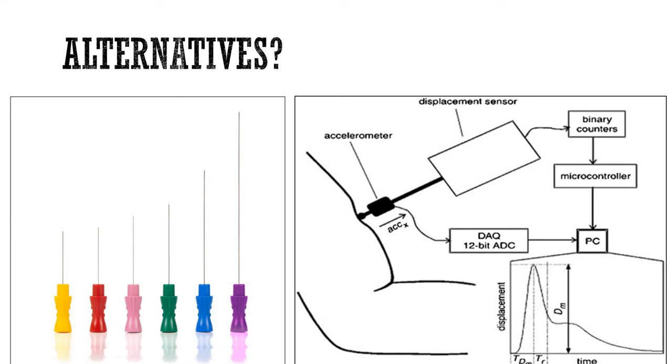The technique we have illustrated here on the right hand side, which again I won't go into great detail, but I will put a link on if you're interested in it, is called mechanomyography. Now, mechanomyography again measures muscle activity, but in a very different way. It looks to measure the vibrations caused by the muscle as it moves, as it is engaged.